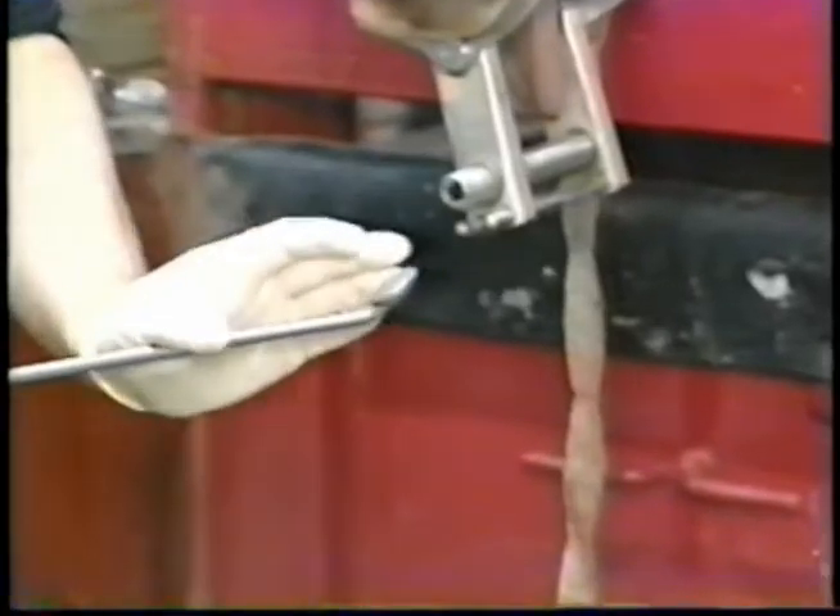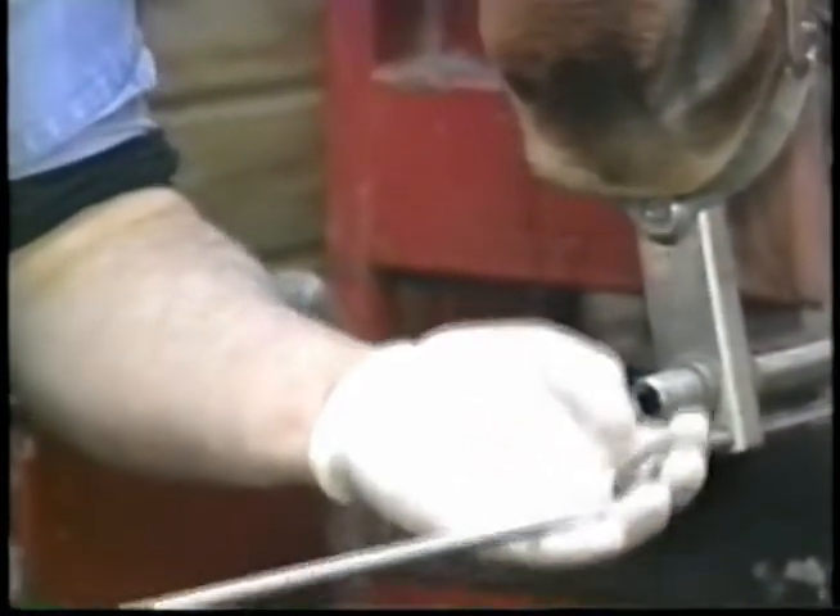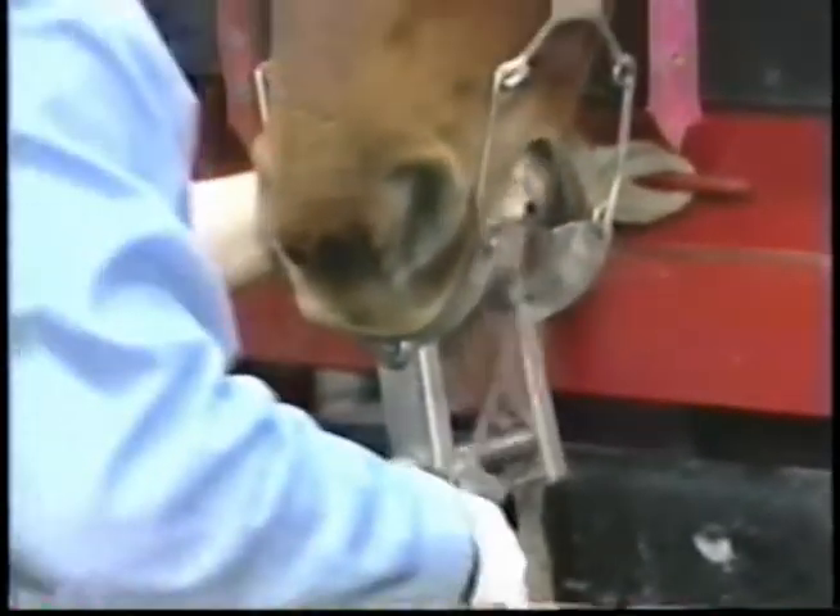The roundness of the instrument makes it easier to manipulate all the way to the back of the mouth, giving us a little better control and more room to work within. We move to the back of the mouth and then back out toward the front. We start at the back, round the tooth, then move toward the front — pulling the enamel ridge off the outside, working back to front, sculpting the tooth so that our dentistry doesn't develop those points once again. We also use this to pull off the 311 and 411 hook as required.